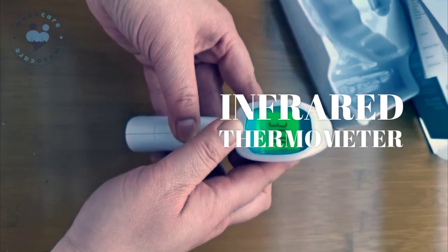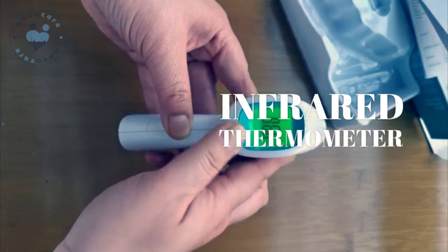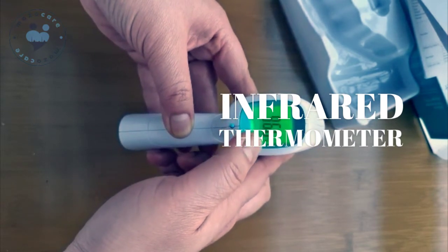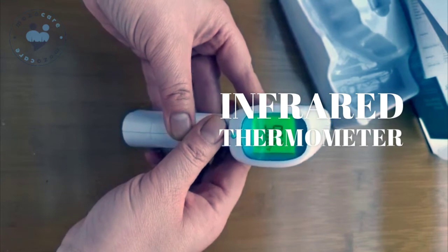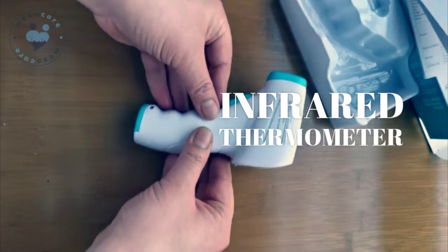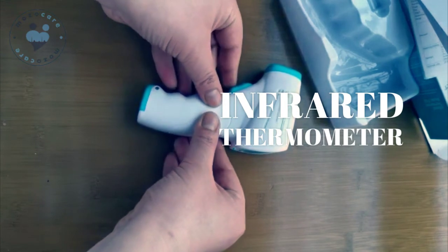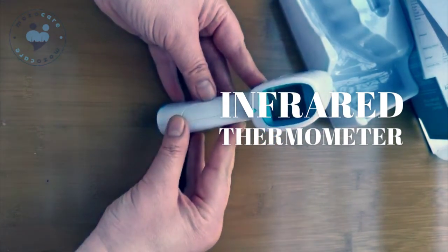Now this is Fahrenheit degrees. You don't need to press anything — once you don't touch this button for several seconds, it will automatically close.